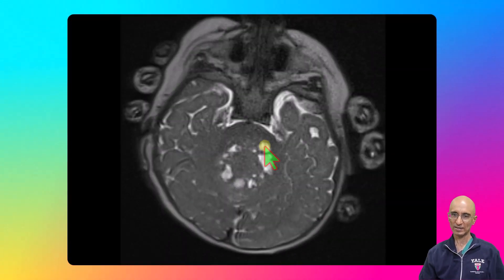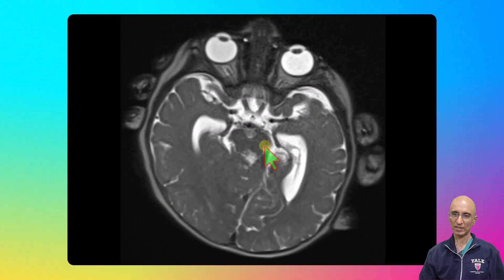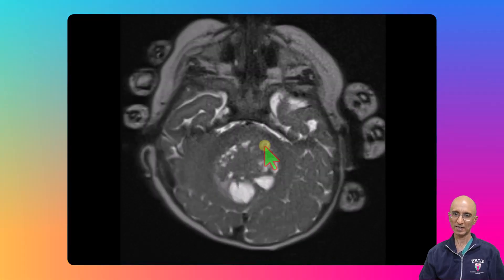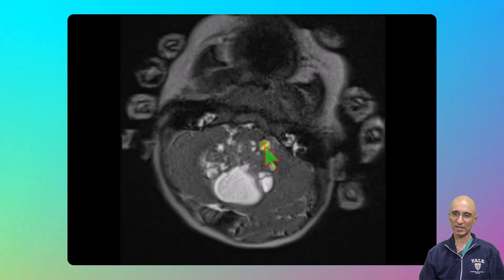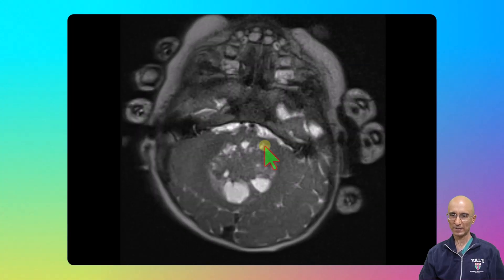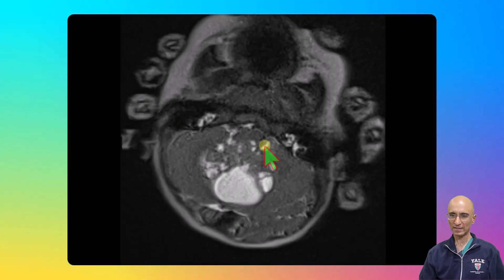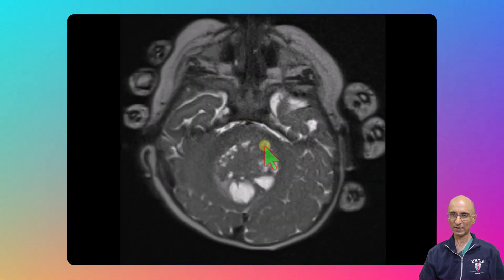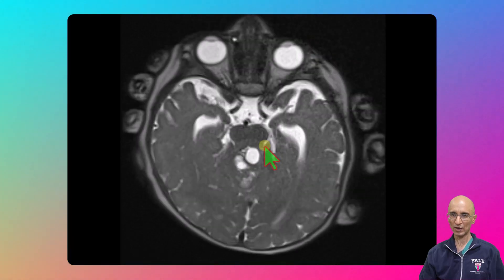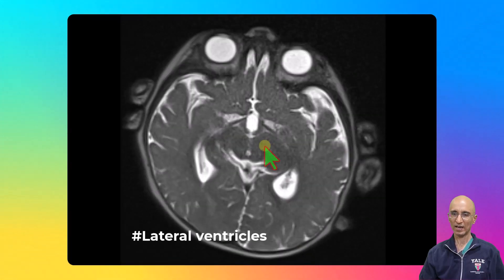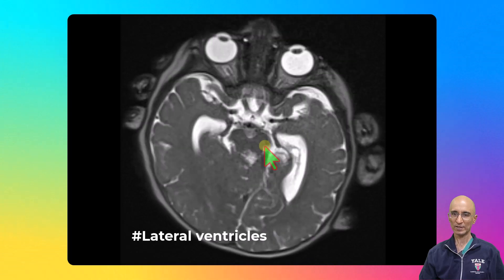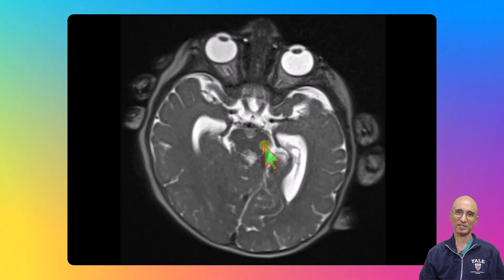As you can see on the axial T2 images, there is a posterior cranial fossa mass which has multiple cystic foci. The epicenter of the mass is likely arising from the fourth ventricle. You can see dilatation of the third ventricle and fourth ventricle. The patient subsequently underwent a complete MRI brain examination under sedation.